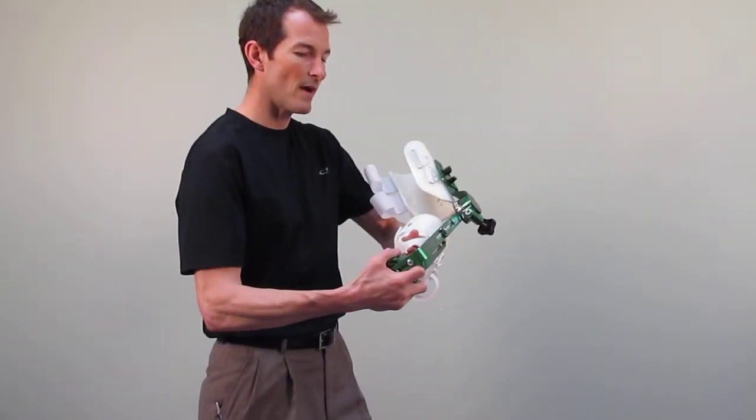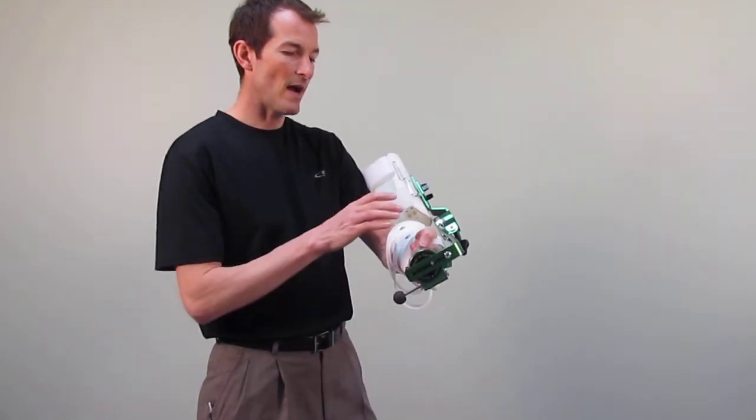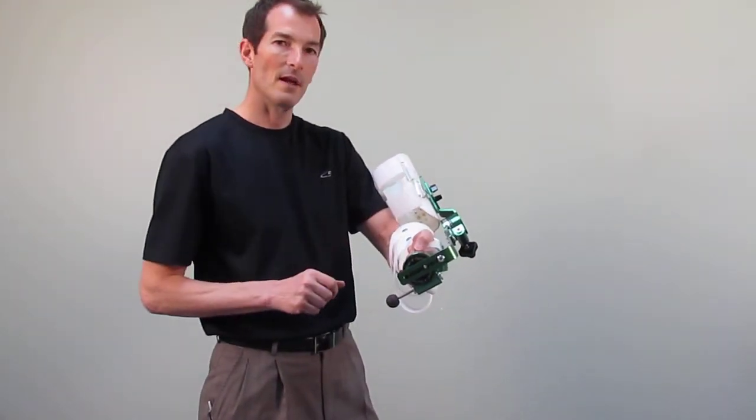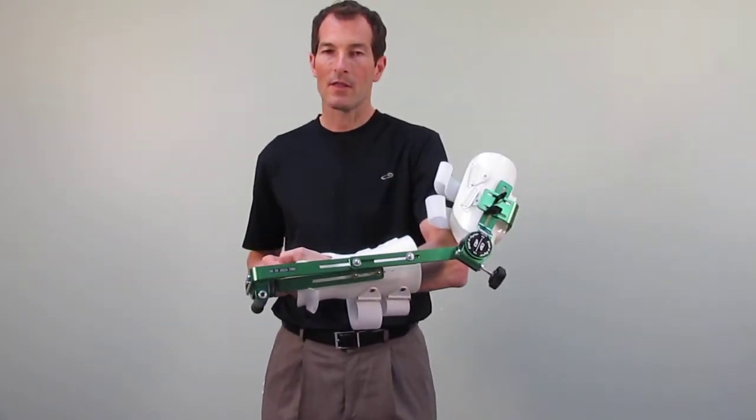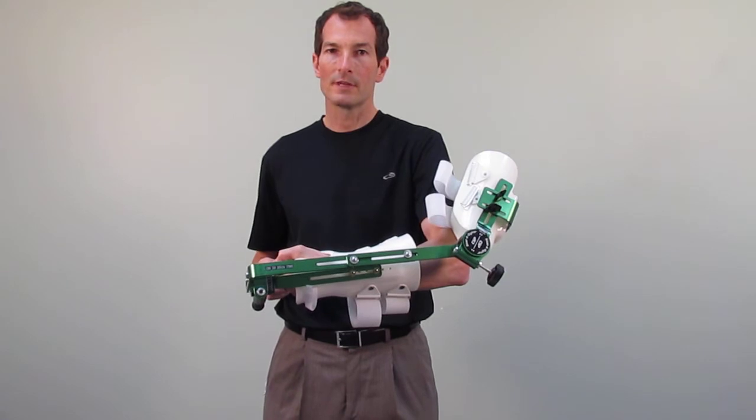In order to don the device, we would encourage the patient to grab the distal forearm cuff and that way the product can be held in place. Once this length is appropriate on the patient, the Phillips head screws can then be tightened.